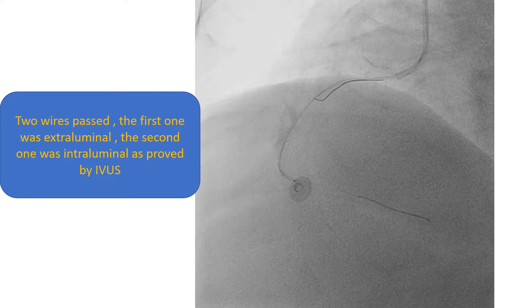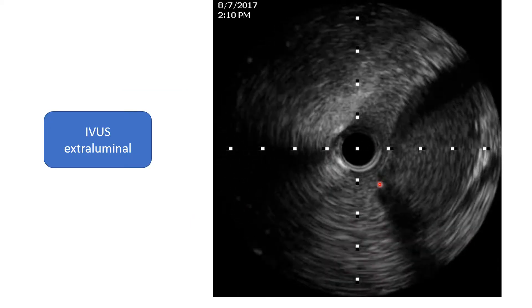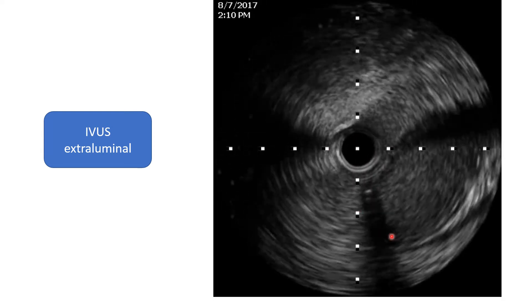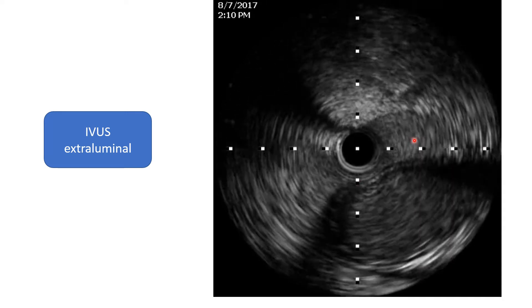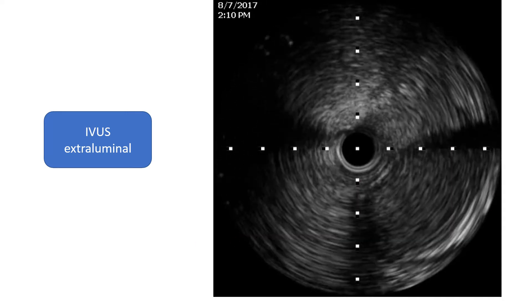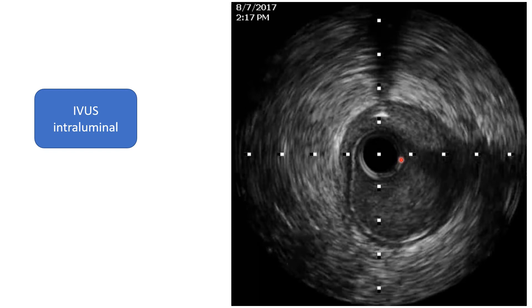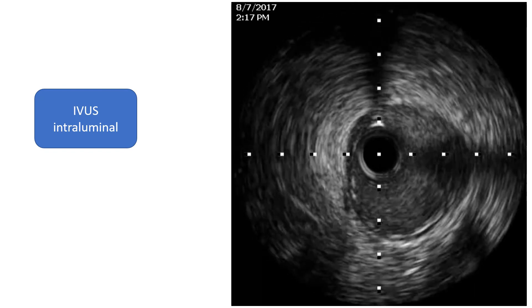So what we did: we tried to negotiate the true lumen. We had two wires — one of them seemed to be extraluminal and was kinking, while the other was reassuring. To confirm which one was in the correct position, we proceeded with IVUS. This is a view of the IVUS over the wire that is extraluminal — we can see the catheter is outside the true lumen. The true lumen looks clear, with intima and media without atherosclerosis. This is the IVUS catheter in the true lumen over the other wire, and it is clearly intraluminal.